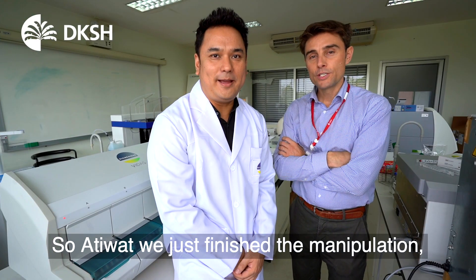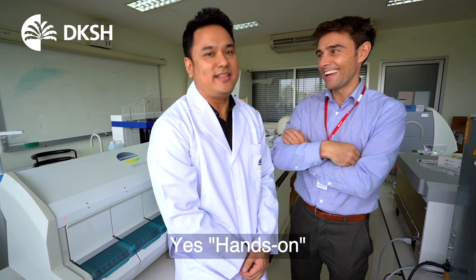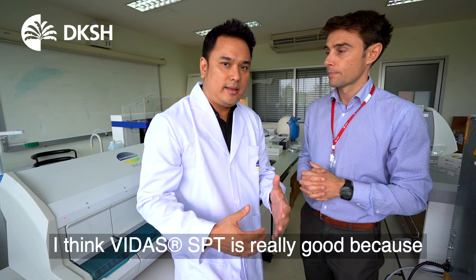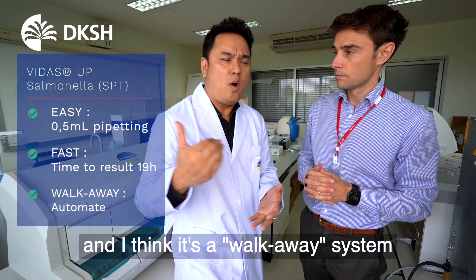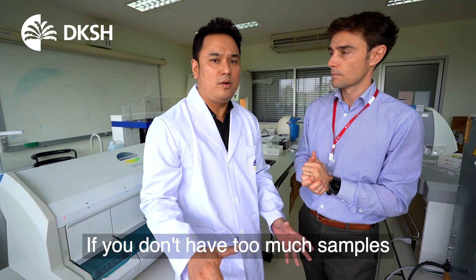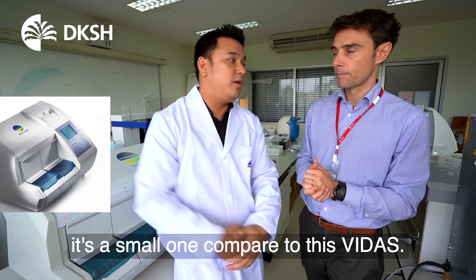So Atiwat, you just finished the manipulation, the hands-on, and it was good — it was actually really easy. Yes, I think the VIDAS SPT is very good because it's very easy, very fast, and I think it's a walk-away system, it's automated. If you don't have too much of a sample, we have a mini VIDAS, a small one compared with the VIDAS.